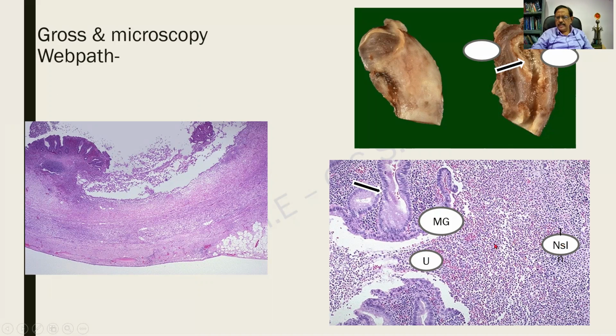And the neutrophils are involving the entire thickness of the section. And they are infiltrating the muscle also. And here it is the lumen that is also showing an inflammatory exudate. So these are the features. I am repeating: mucosa with ulceration, neutrophils extending into the muscular layer, and the exudate spilling over into the lumen.